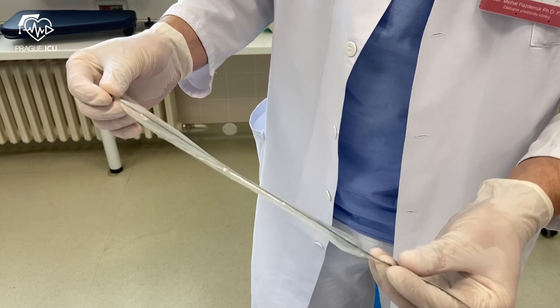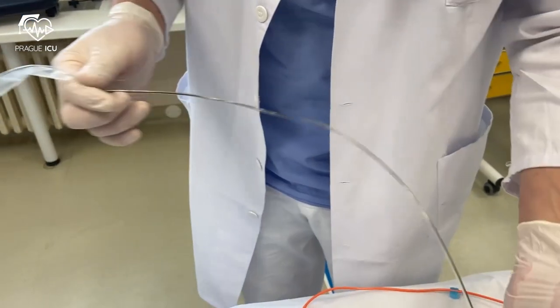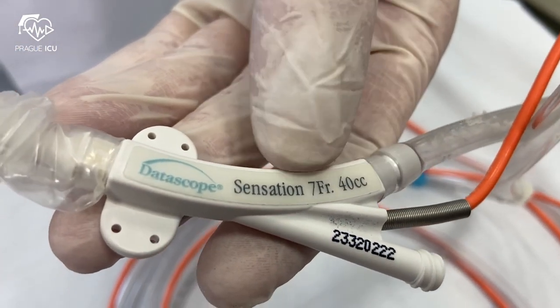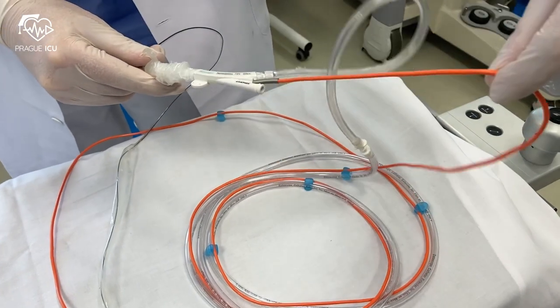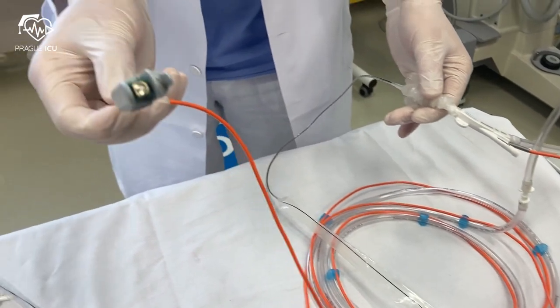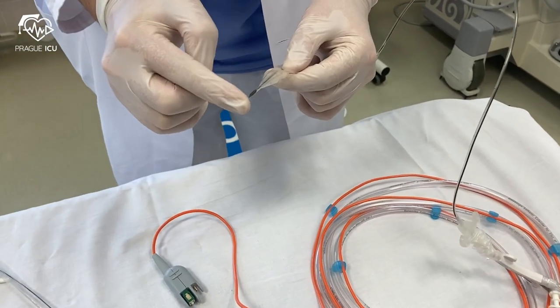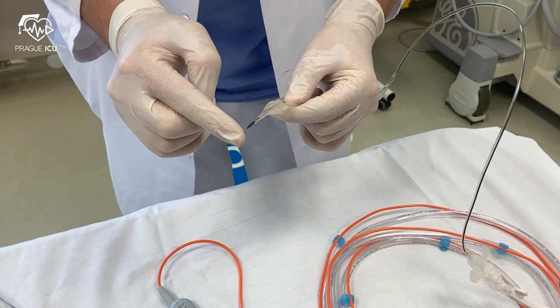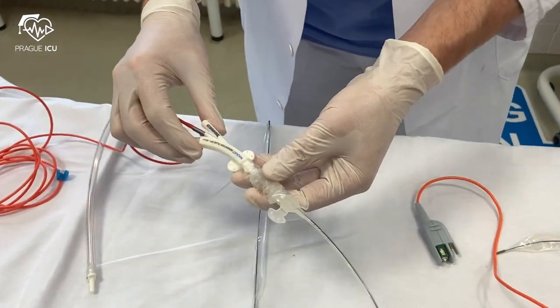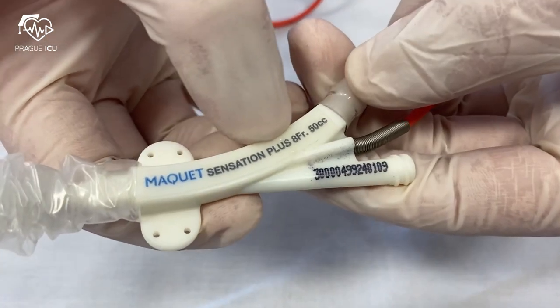Here you can see the 7 French 40 ml volume balloon suitable for patients with height from 162 to 183 cm. This is the fiber optic cable which captures and transmits the high fidelity arterial pressure signal from the tip of the balloon pump at the speed of light. In contrast, in patients taller than 183 cm, we use the larger 8 French 50 ml balloon.